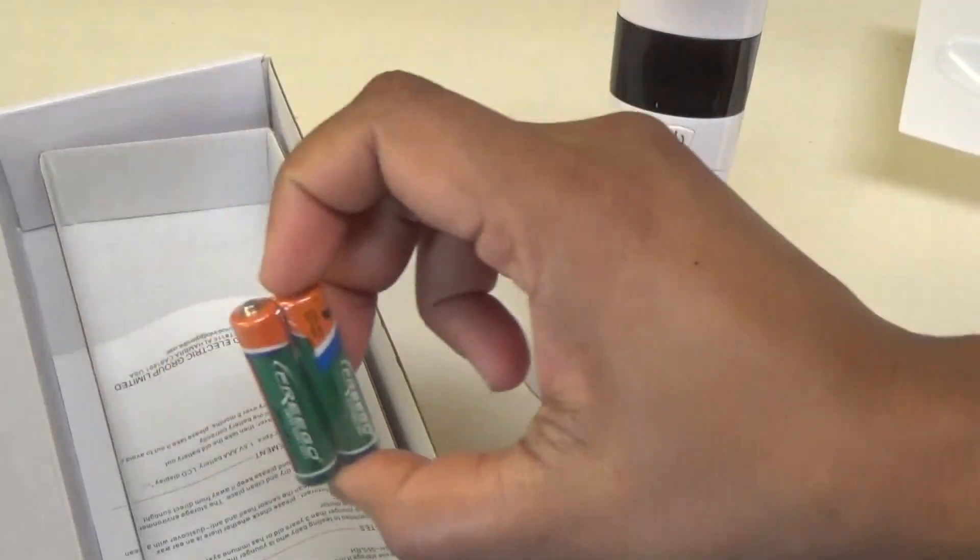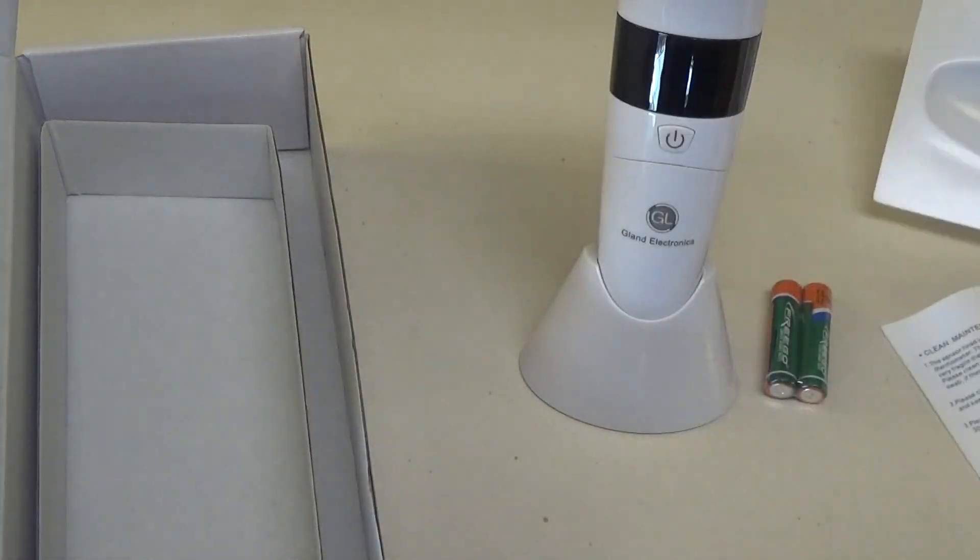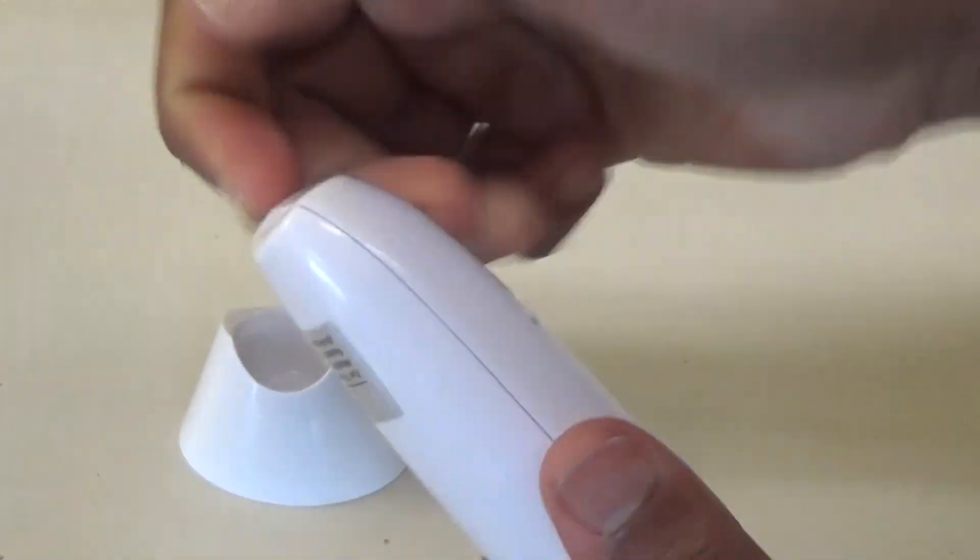What we have in the box: two AAA batteries and the instruction manual. To insert the battery you're going to pull up against the bottom here.